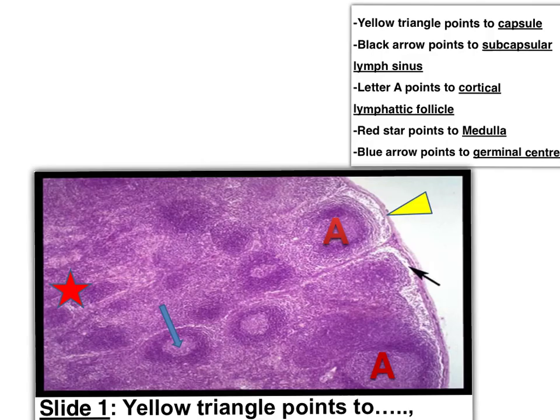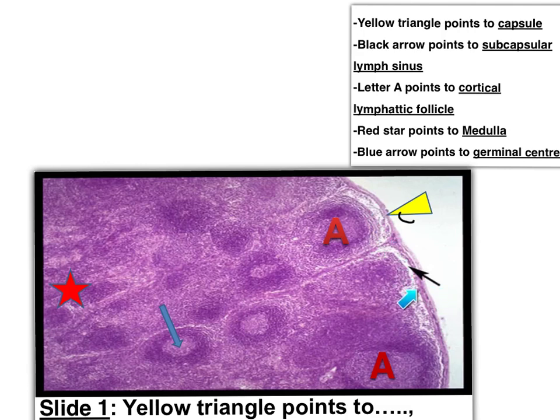Now we will start the trial exam. The yellow triangle points to the red line, so it is the capsule. The black arrow points to the white space, so it is the subcapsular lymphatic sinus. The letter A points to the cortical lymphoid follicle — it is a secondary follicle because it has a pale germinal center.